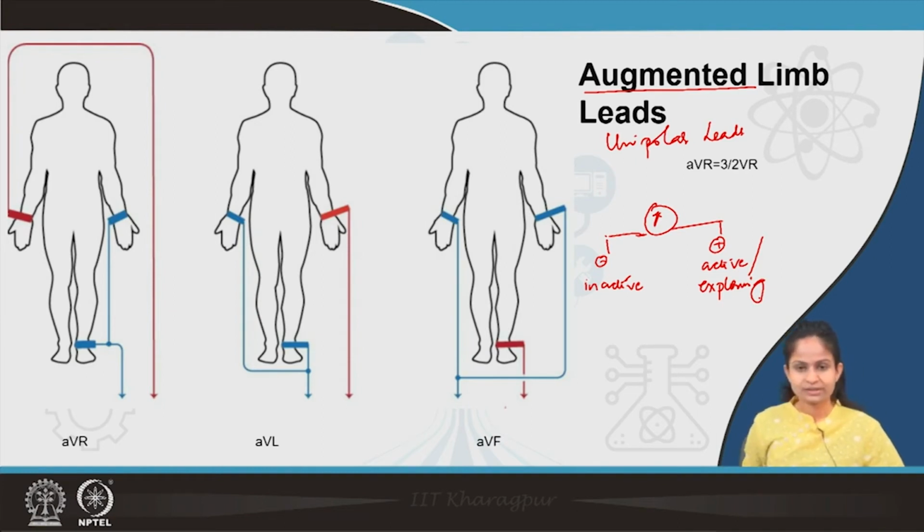Now, the negative electrode is inactive, meaning it is made inactive by keeping it fixed. A very specific term can be used, that is fixed, that means the voltage is fixed, and this voltage is usually made close to, not exactly equal to, 0 millivolt by combining it with high resistance.